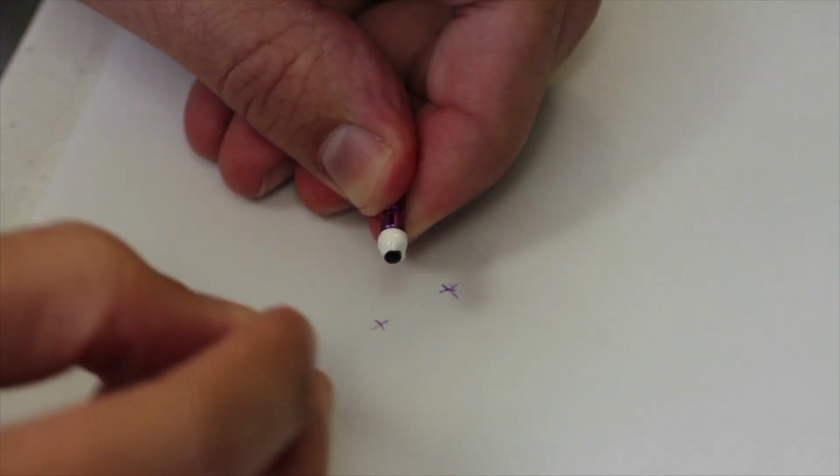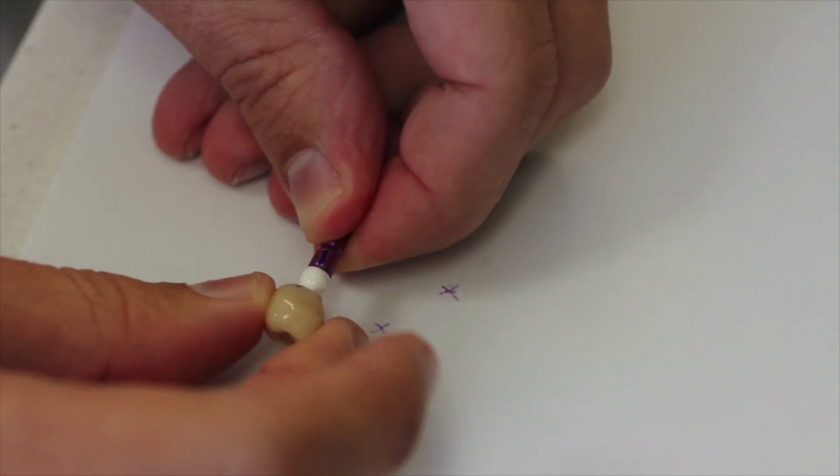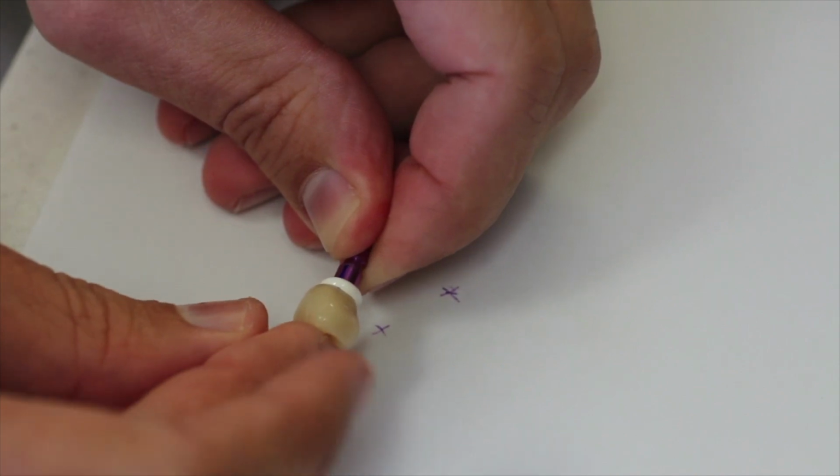If I placed Multilink Hybrid Abutment inside the Emax abutment, you would need to block out the screw access hole. So at this point, we'll line up the two marks with the waterproof marker we made and press firmly to make sure it's seated.